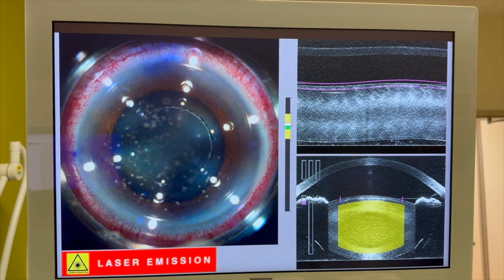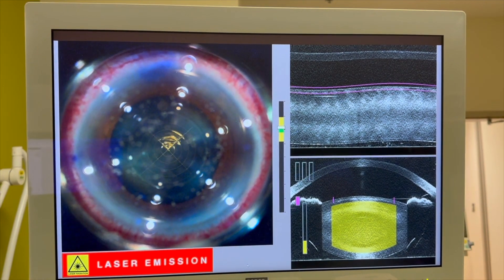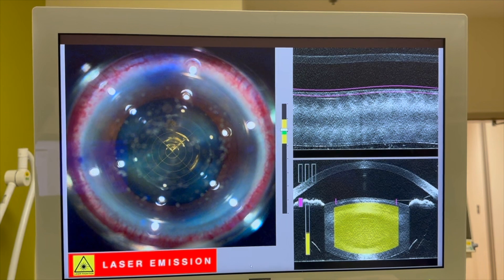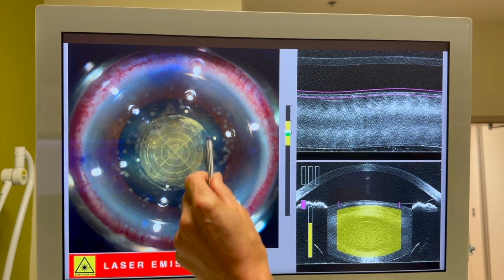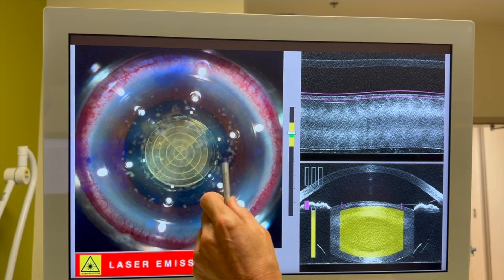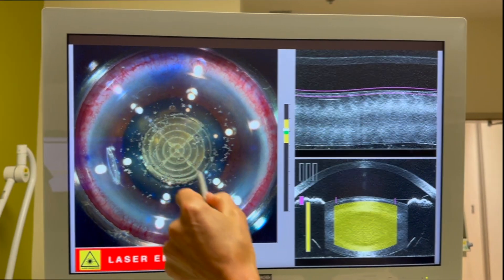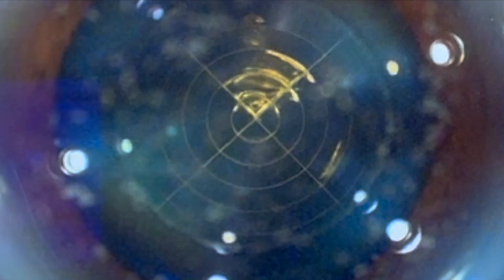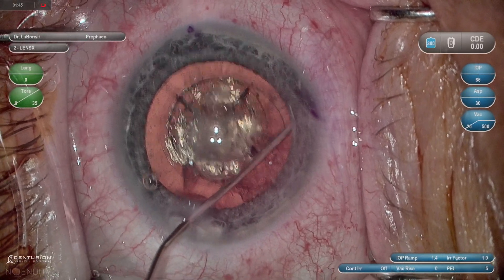Here's an additional case showing the horizontal cut with the Rev-H technology. Starting from the bottom the lens is being broken into cylinders, and then at 50 percent depth there's a horizontal cut, and then the rest of the cylinders are created. The chop pattern is still placed within the cylinders. Here's a HiMag version — you can see it starts from the periphery and moves central.